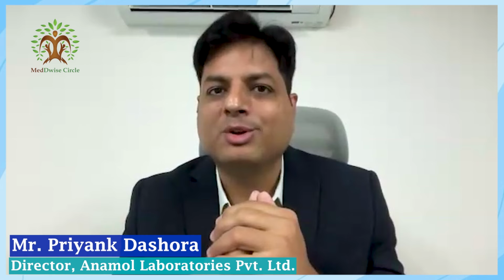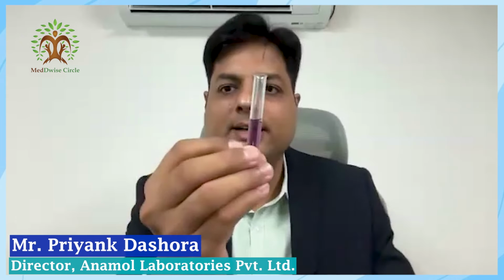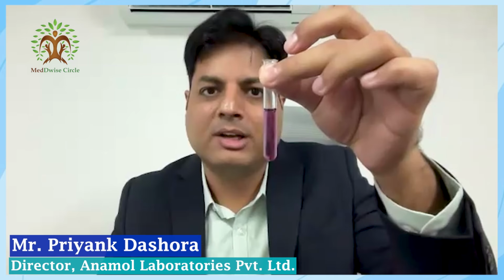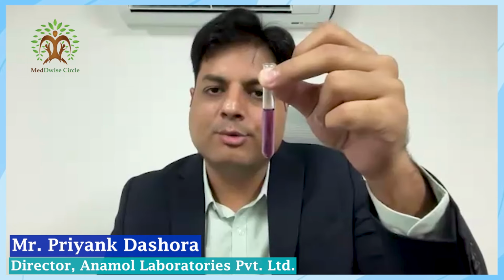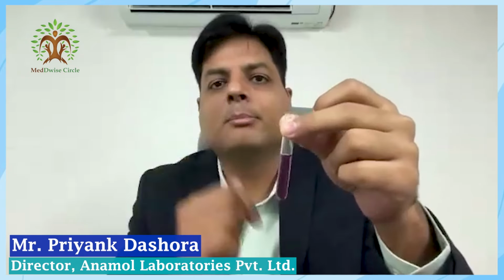Because technically, what do we do in a pathology lab? Just imagine that we have to find out the concentration of glucose in a patient sample. What we will do in a pathology lab is, we will take the reagent and add the reagent in something called a test tube. I hope you can see this. There is a solution in the test tube. Now, just imagine that in this test tube, we have added the glucose reagent, and in that we have added the patient sample, which is human serum.